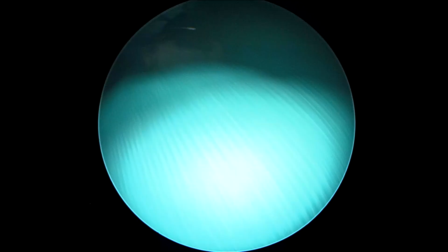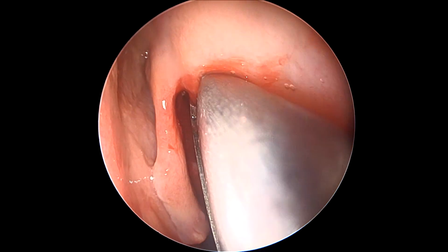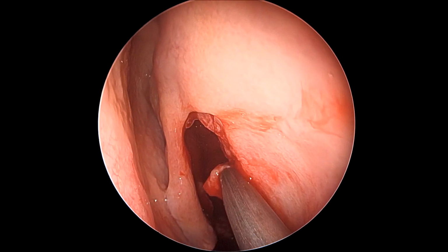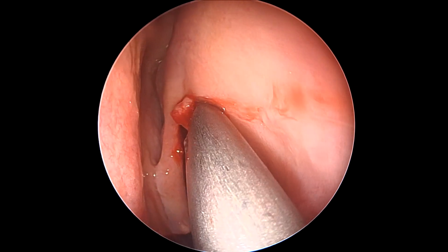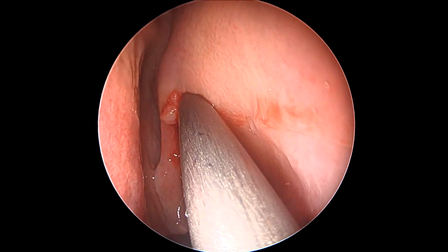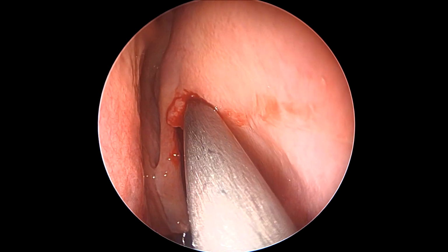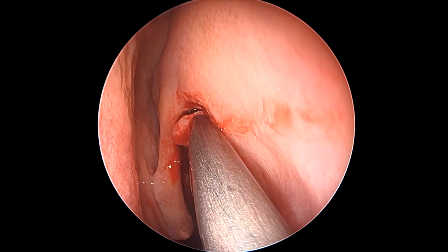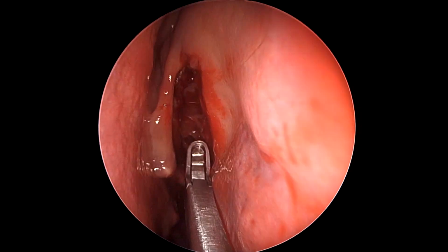This helps us significantly in ensuring that post-operative irrigation can reach the frontal recess cell and the frontal sinus and reduce the polyp formation. To increase this slightly further, we would do the same thing that we did on the right side, which is taking down the anterior wall of the agger nasi slightly using a straight Hajek-Koffler punch. Once again, one must be careful not to destabilize the middle turbinate while going too medially. So this is just superiorly essentially and slightly laterally, as much as the straight punch allows us to do.